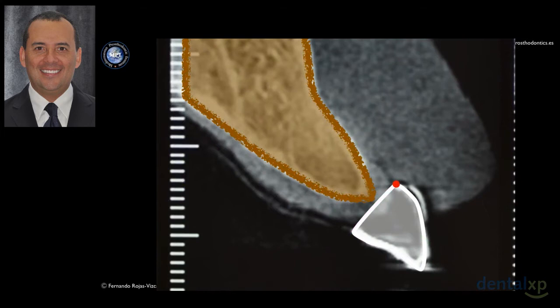So, by doing the analysis, I will determine that 3A needs to be here. I need my implant 3 mm apical from the margin. So I need to reduce this bone if I want my implant at 3 mm. And later, I need to place the implant in a palatal direction enough to create this 2B.